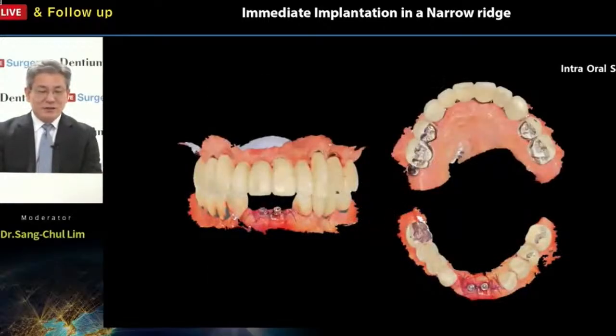And after that, intraoral scanning here for the temporary PMMA, right? The same day scanning or the stitch-out day scanning, it doesn't matter. For me, actually, same day scanning is a favorite. The surgery day scanning, and then 1 or 2 weeks later, the stitch out, and then give the PMMA temporary prosthesis to our patient's mouth.